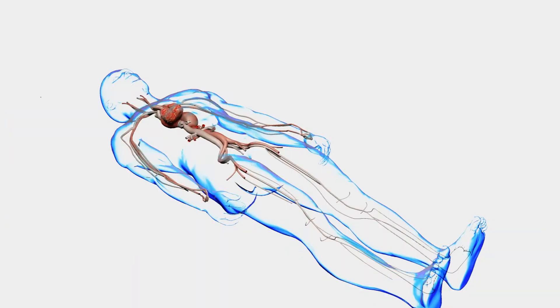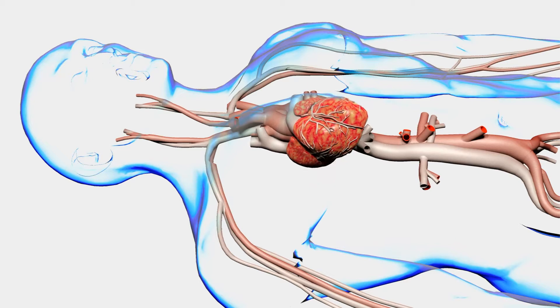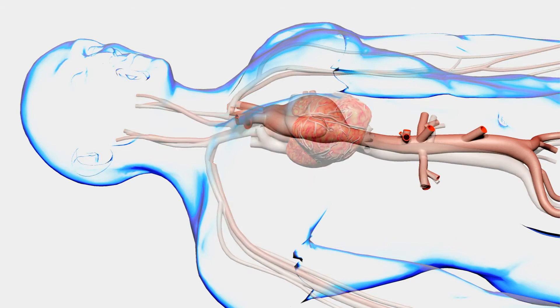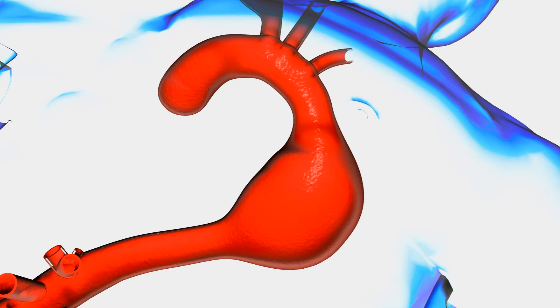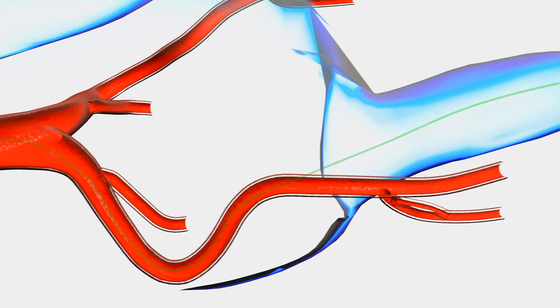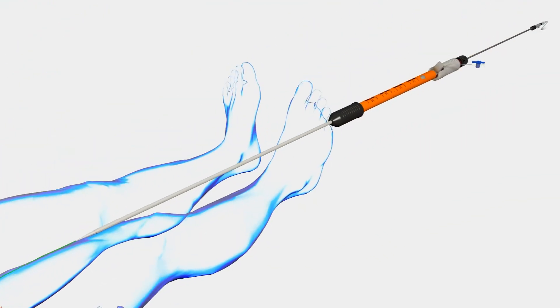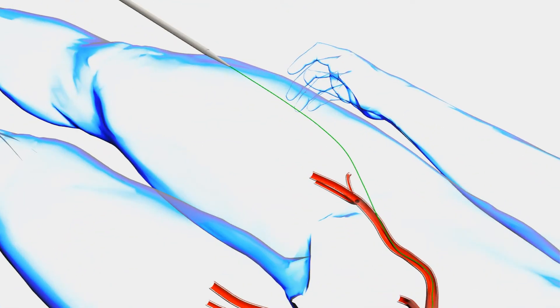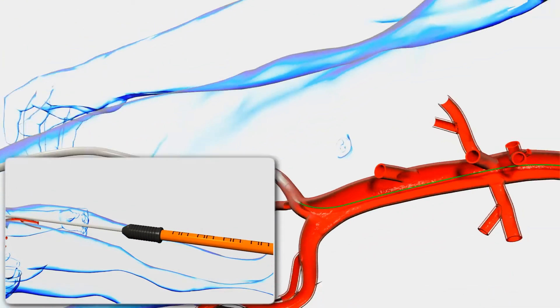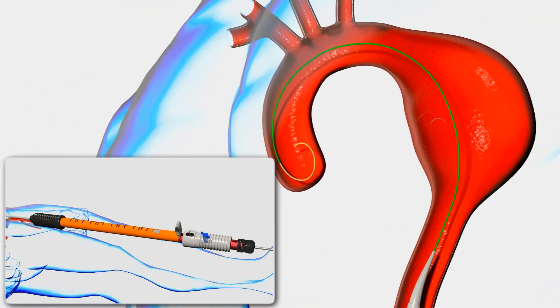We will now view animation on the deployment process. Under fluoroscopy, introduce the PLUS delivery system over a .035 guide wire and advance until the tip reaches the approximate distal landing zone.